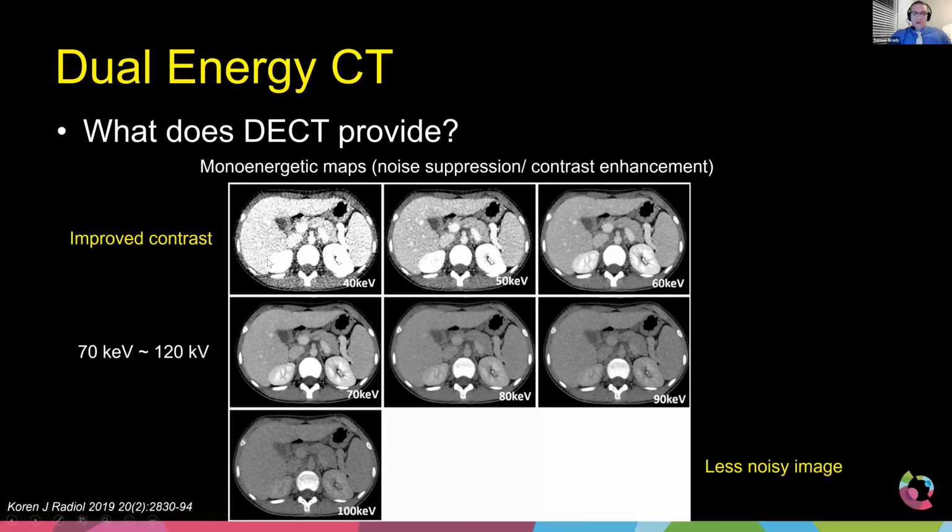And so if you are trying to look at a high contrast image, but you also think it's too noisy, you can simply dial it back and look at a less noisy image, or keep dialing it. Instead of windowing and leveling using your mouse, where it goes gray and changes the grayscale, in this case you can also shift it left to right and change the contrast effect in the image. So it's actually very powerful. There's just a lot of information.